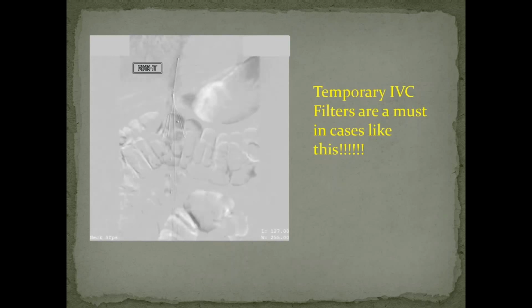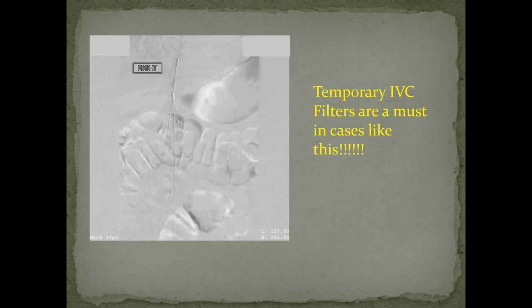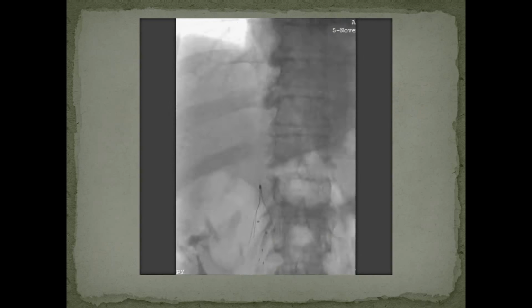This is a massive thrombus extending from the iliac vein all the way to almost the suprarenal IVC. And if you look at the image, you can see the thrombus is actually mobile. It's moving back and forth. It doesn't play as well in this video here. But once I saw this, I stopped the procedure where I was. I flipped the patient supine, accessed the contralateral groin, and placed a temporary IVC filter just above that massive clot burden. So in my mind, cases like this mandate temporary IVC filter placement.